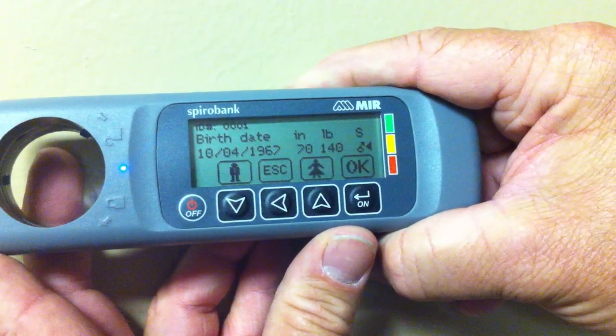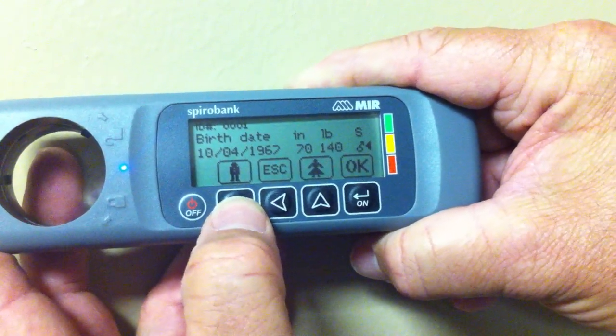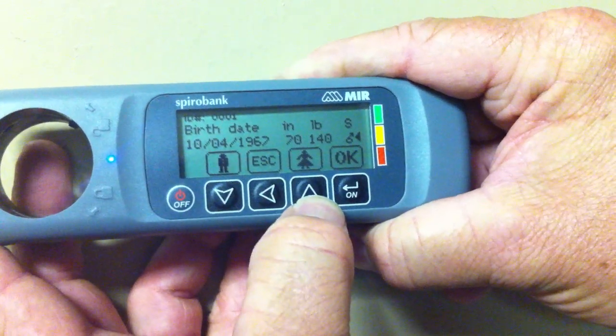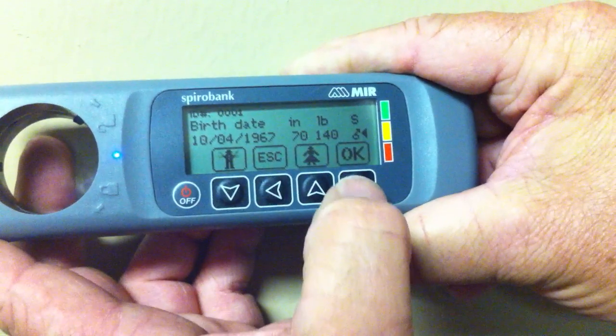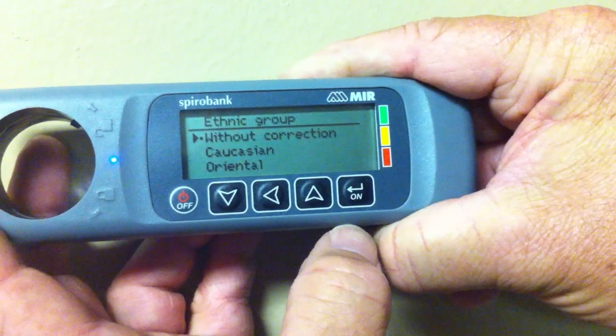Select the sex of the patient. Use the down key for male, or the up key for female, then press the OK button.